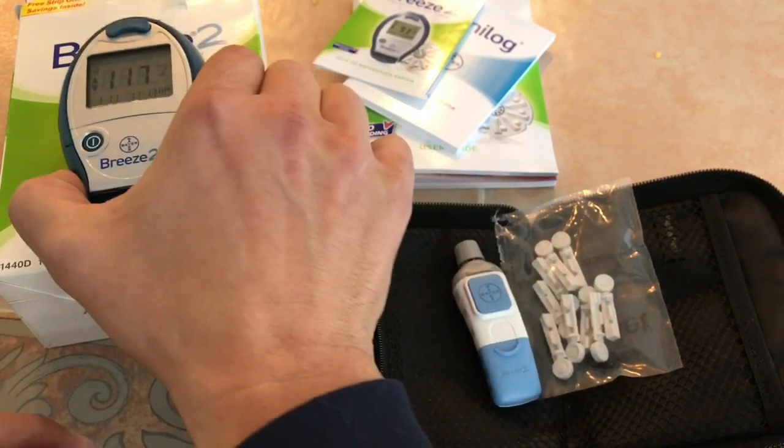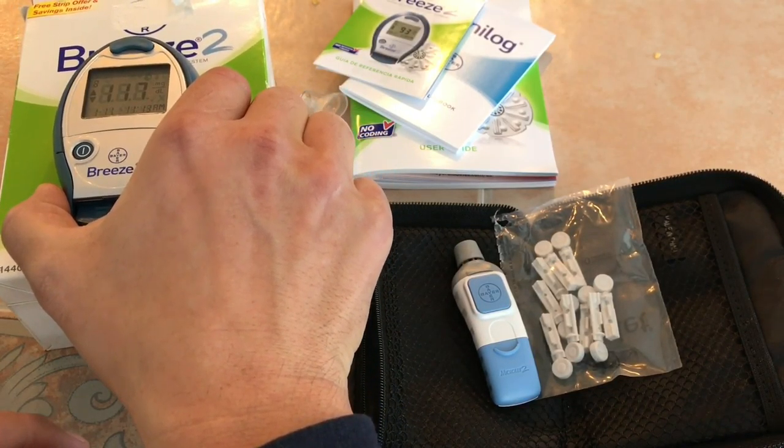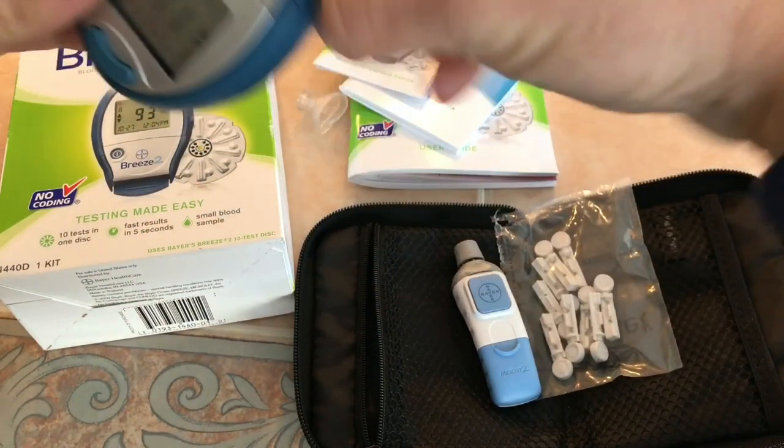It's about noon and I've only had fat coffee today. There's no way that 117 is my blood sugar level.